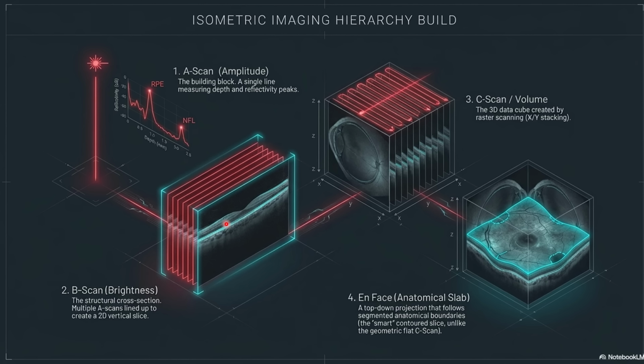you cannot know which part of the retina this pathology is present in. So it is present in the anterior-posterior location, but you cannot determine the pattern or the depth of these lesions, or how extensive the lesion is inside the retina. So you need a three-dimensional picture. Now comes the C scan. The C scan is three-dimensional volumetric data which is gained from plenty of B scans.